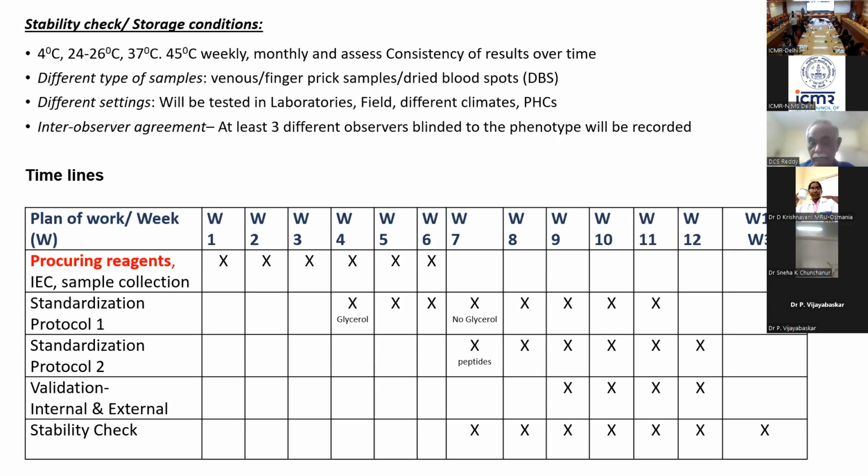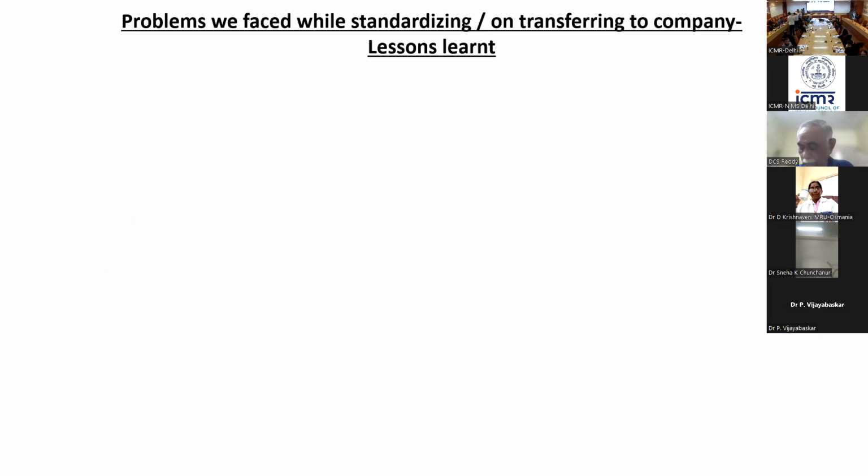And when you're ordering for this, you will order very minute volumes initially because you don't know which antibody is going to work. By the time it works and you realize, "Gee, this is the one which works," again, that's a 6-week protocol start. So I think the most annoying part of developing something is the procuring of reagents.